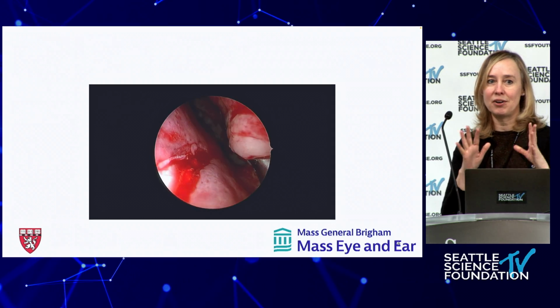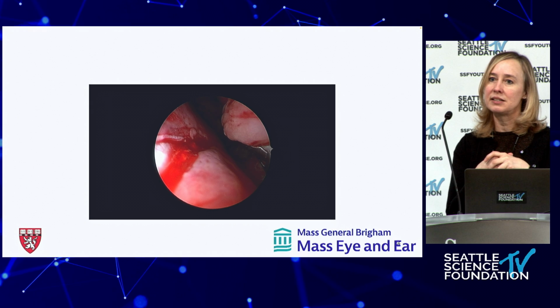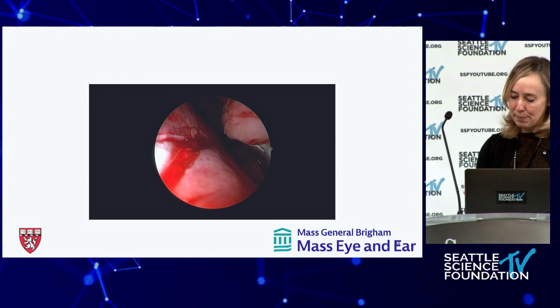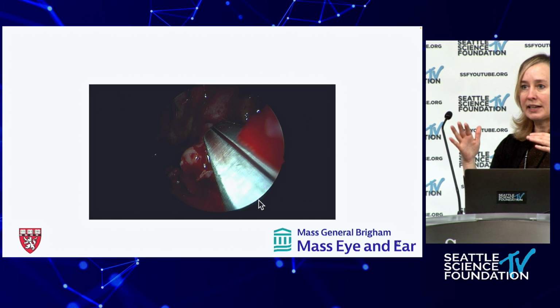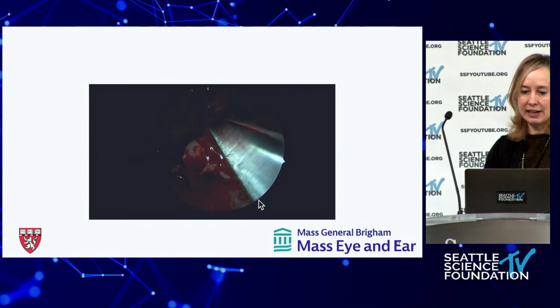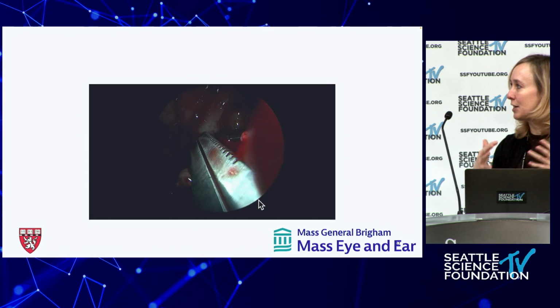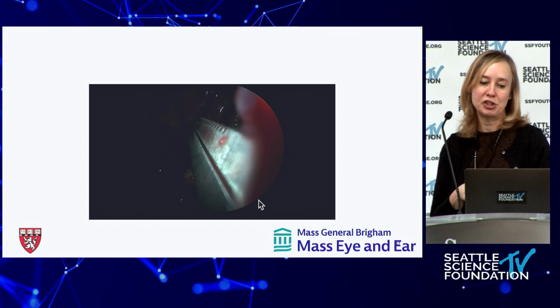And these first cuts are always a little challenging because viewing it with the scope while you're doing it is a little hard, since you're working in the front part of the nose. Removing that piece of the inferior turbinate first. Usually we like to make a mucosal flap. In this case, I did not do that, obviously, because she has a history of tumor. So you want to make sure that you're actually removing that. I didn't want to put mucosa back, especially because it was radiated tissue.